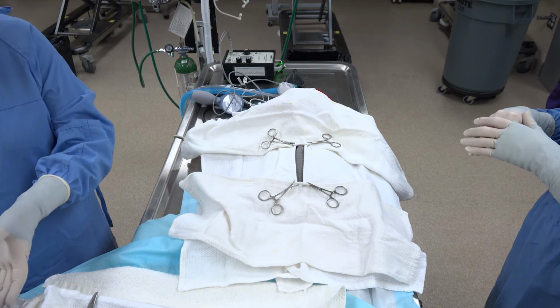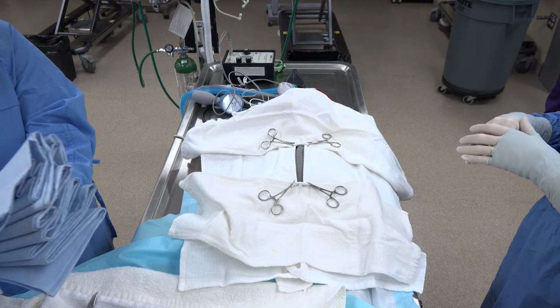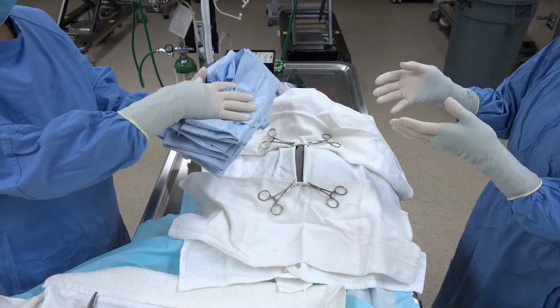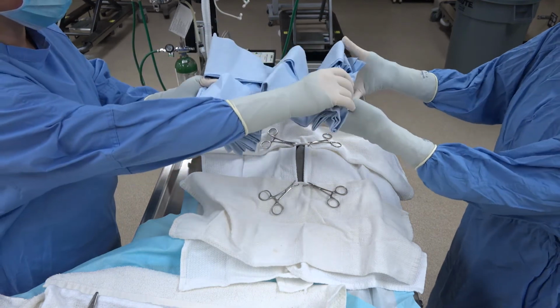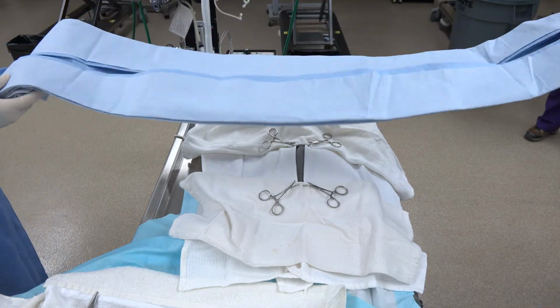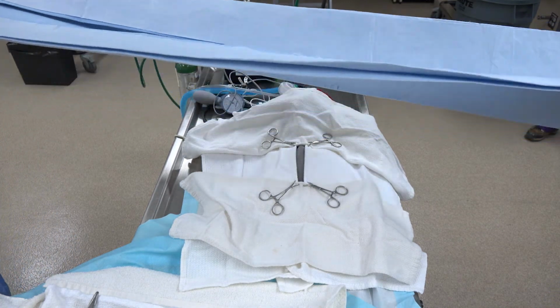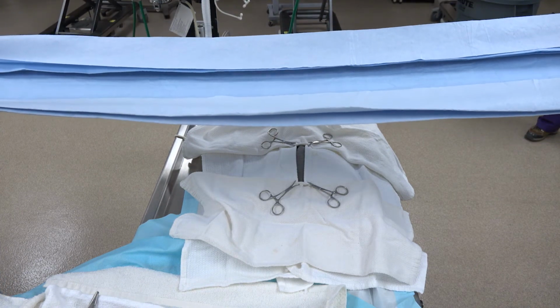So now we're going to go to the big drape. All right. So now, this can open multiple ways. This is the way I like to do it, is I open it this direction. So Sue is going to take her half. I'm going to take my half. We are walking away from the table so that we still keep it up off of the patient, because as soon as it touches that stuff down there, it's contaminated on the underside.